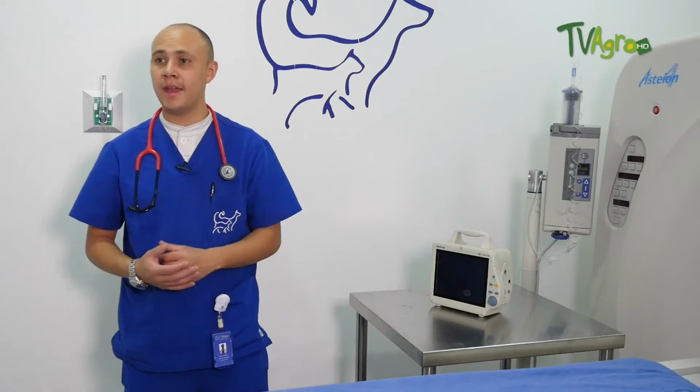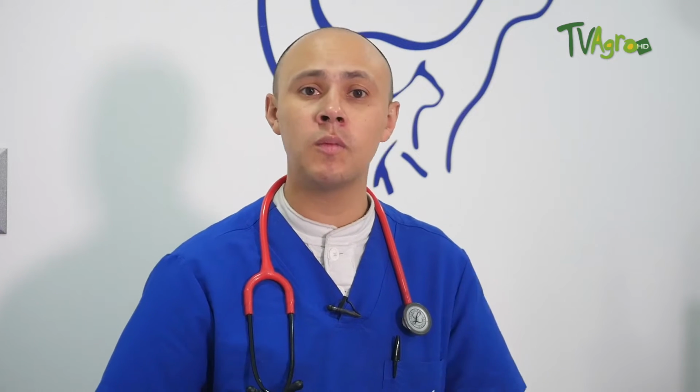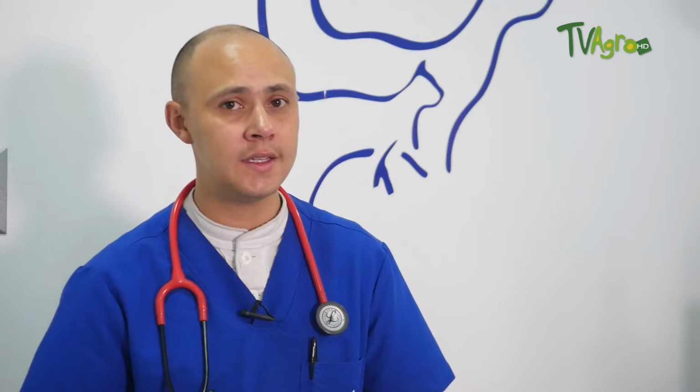To keep in mind, as I mentioned, there are also limitations in the neurological area on this equipment. But it also gives us the opportunity to diagnose quickly, as is done in humans, where these appliances are used to quickly diagnose strokes when they are generally acute. It is a very useful diagnostic tool. As I was saying, it is a device that takes very little time to obtain the images, so the patient will be under anesthesia for a very short time.